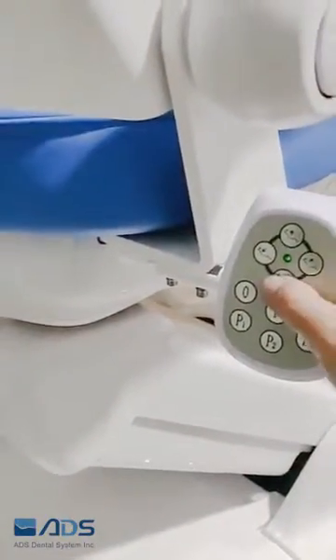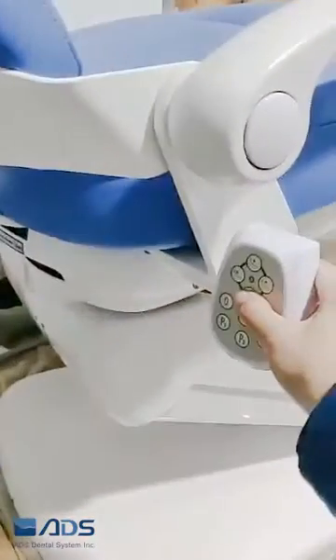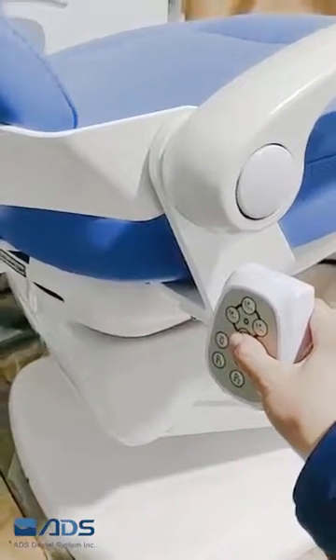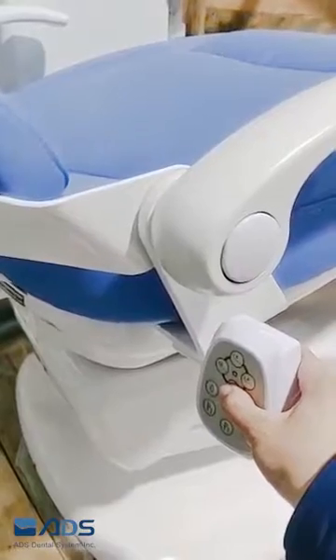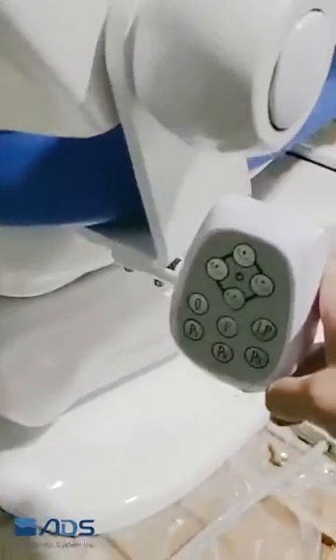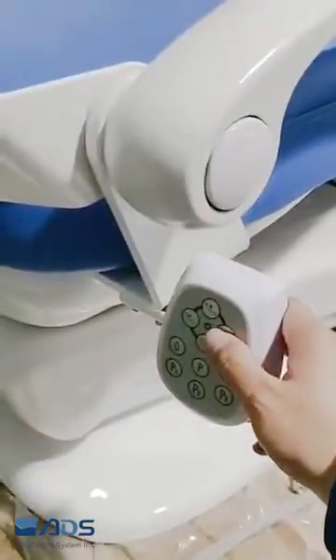Move the chair lower to the lowest position, then put the backrest up to its limit.